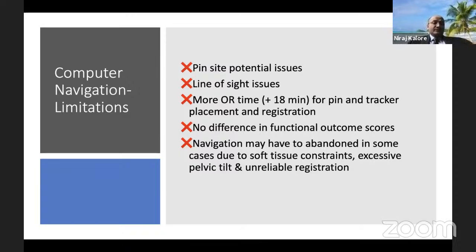Besides that, even if you use it, it doesn't really translate into functional improvement for the patient. In other words, if you do a manual hip replacement and you do a computer navigated hip replacement, the patients are not going to have much difference in function. And that's kind of a theme in most of these technology applications.